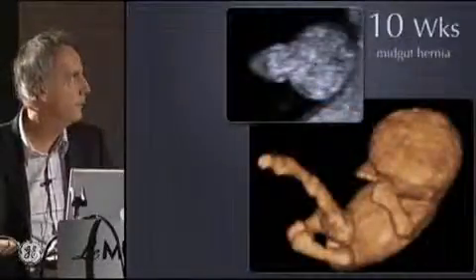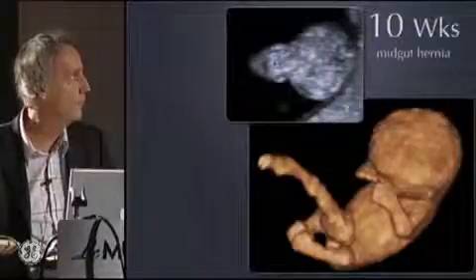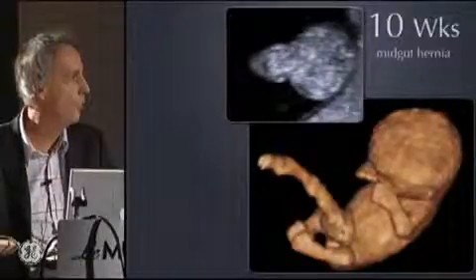This is the midgut hernia. You can see here on 2D the presence of intestine inside the umbilical cord.